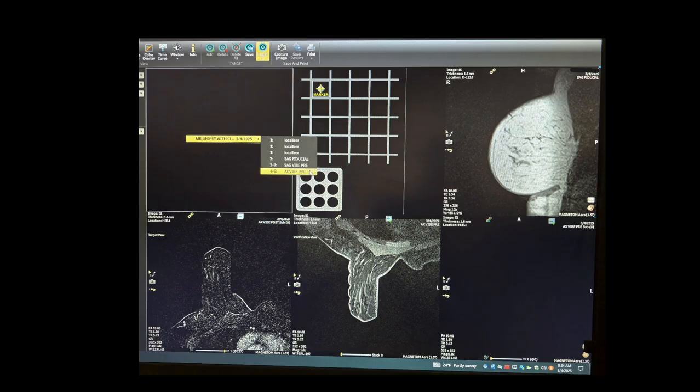and when you check those, especially the pre-contrast image, you want to make sure that your target is going to be where the grid is, and you check that not from this Dynacad image but from the actual images on PACS. And if you feel like you are going to be able to access your target in the region of the grid, then you go ahead and you tell the tech, yes, go ahead and give contrast, and you will get post-contrast images.